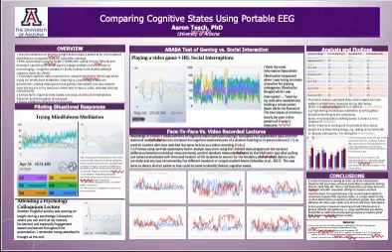So I wore an Emotiv Insight during different activities. The first activity that gave me some insight into what the Emotiv Insight could do was trying meditation. A couple years ago, I had fainted in the middle of telling my students how an action potential, the firing of a neuron, happens.